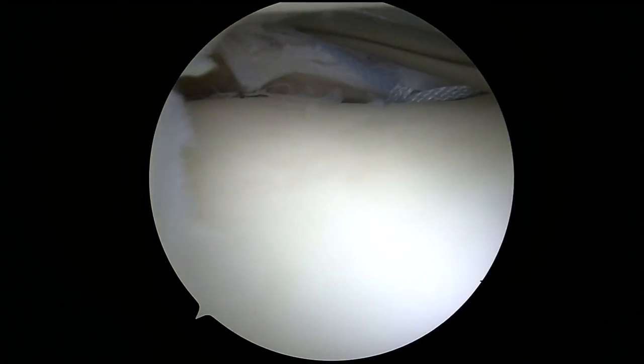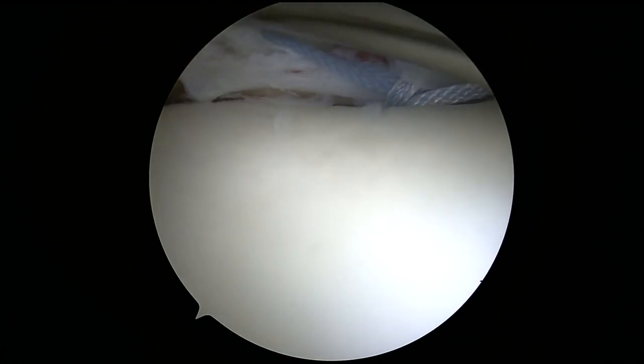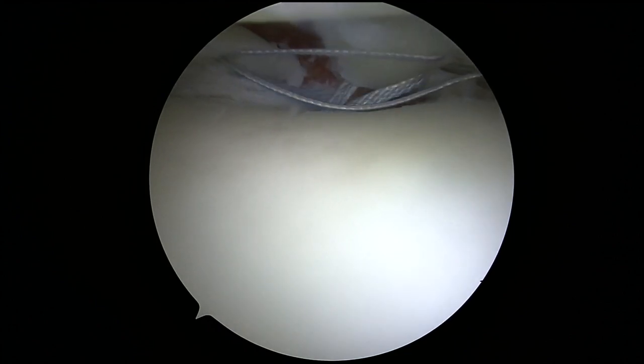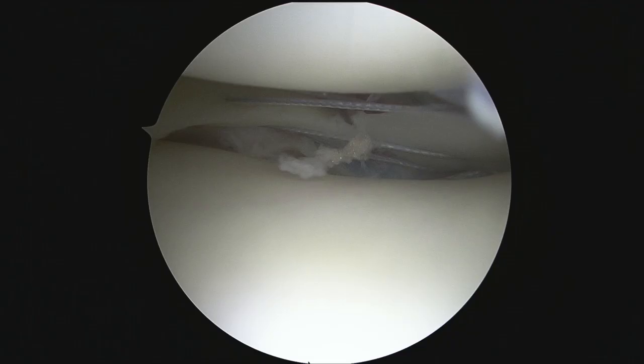With the sutures from the transtibial tunnel repair acting as vertical mattress ripstop sutures, six inside-out sutures are placed in a horizontal mattress suture fashion on the superior and inferior surfaces of the meniscus.